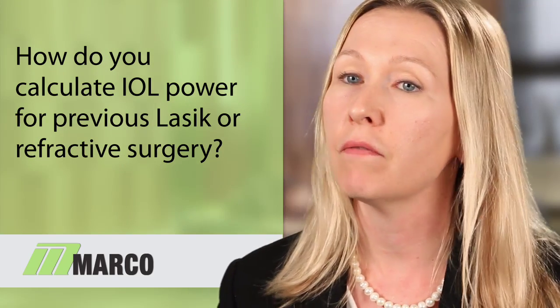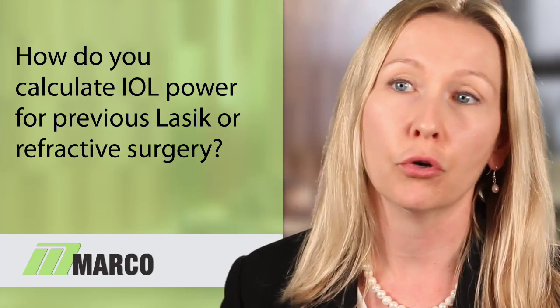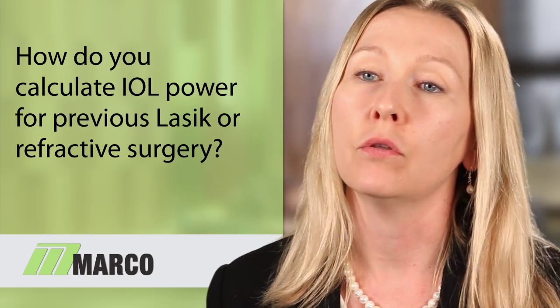Many times, if I have no other information, no historical data, I use that number frequently to plug into the formulas and to derive the IOL calculation. I have found that to be a very accurate way of determining the central corneal power in post-refractive patients.